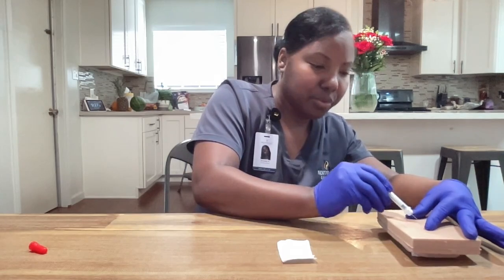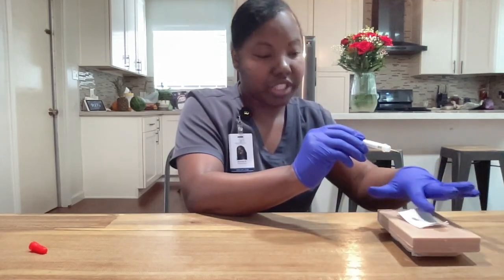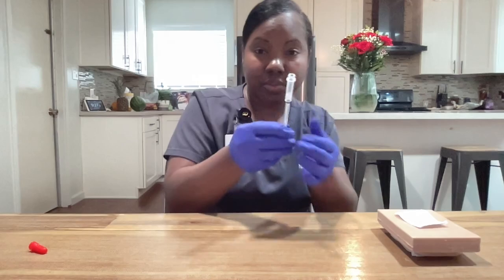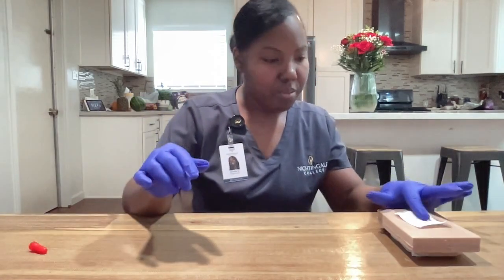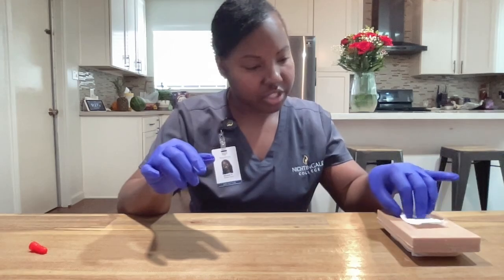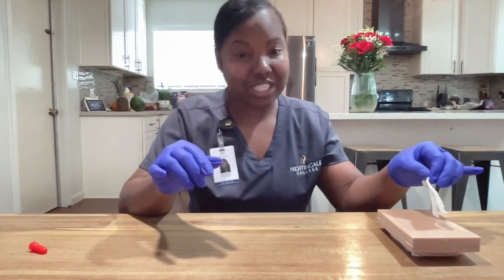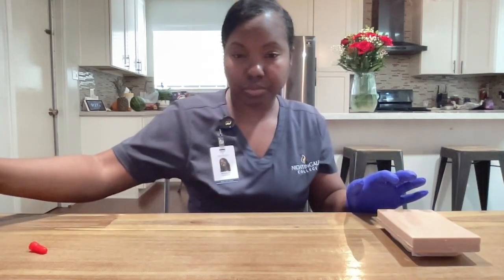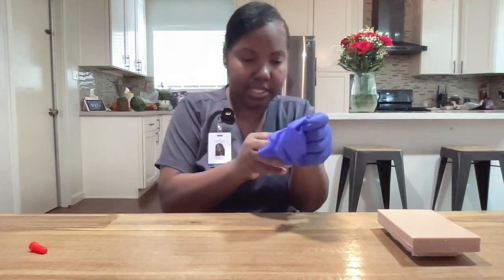I'm going to remove the needle slowly, gently place the gauze on top of the injection site, release the safety cap on the needle, and place the needle immediately in the sharps container. Mr. Jones, are you okay? There's no blood, so there's no bandage needed. I will dispose of the gauze.